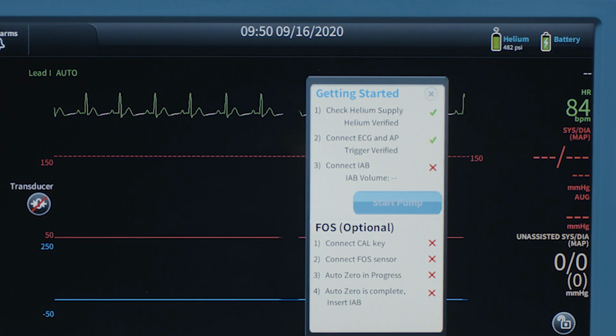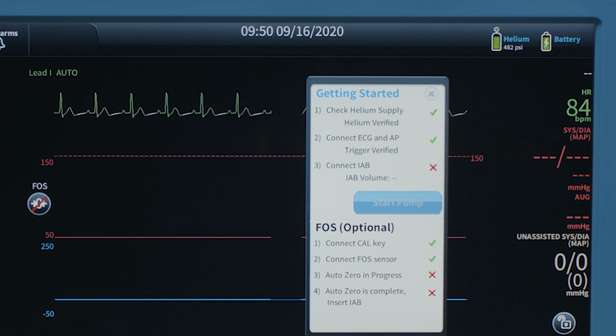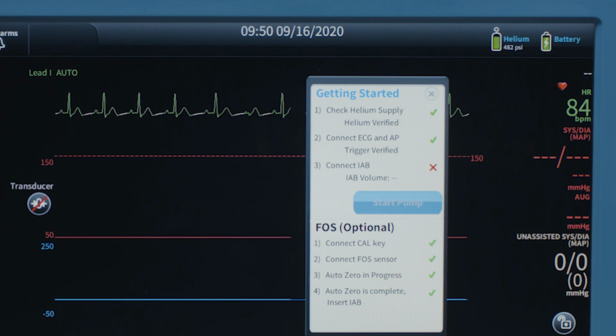Once these connections are made, the AC3 Optimus IABP will automatically zero the sensor if no arterial pressure is detected. This takes between 8 to 15 seconds to complete. When the zero is complete, a 4-beep tone will sound. The IAB can be inserted after the zero is complete.